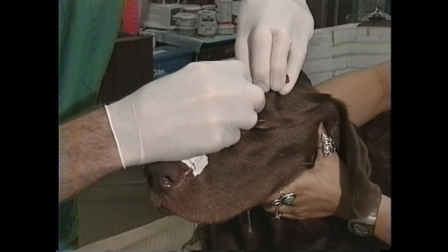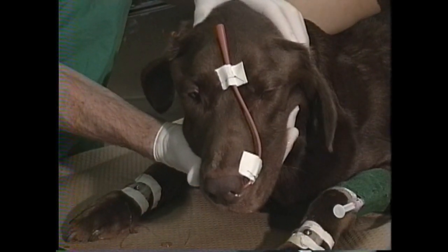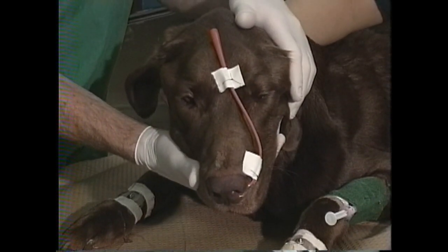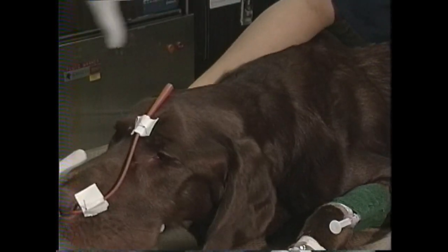The suturing technique is the same as for the first one — I'll place a needle through the tape, grab some skin, and out the tape on the other side. Despite my effort this isn't great in that it wound up pulling somewhat into the field of vision for the left eye, but I think it'll be acceptable. If it were any worse I would repeat it and do even more aggressive over-correction on that S-curve to make sure it didn't end up in the dog's direct field of vision.